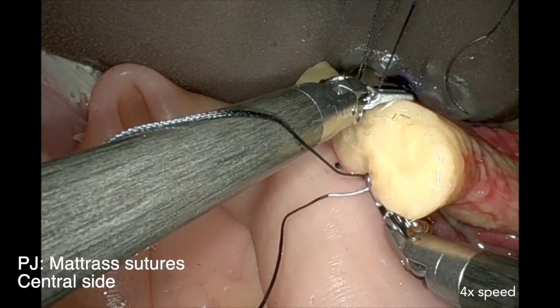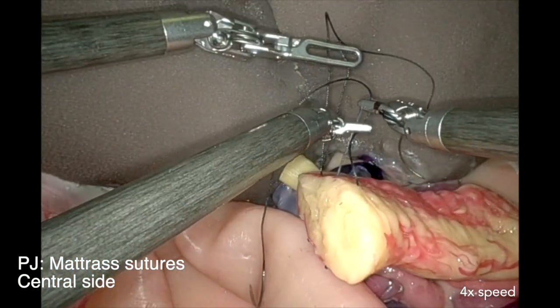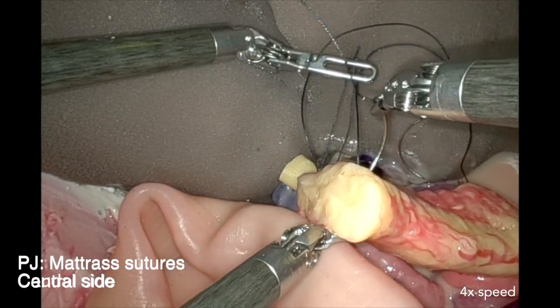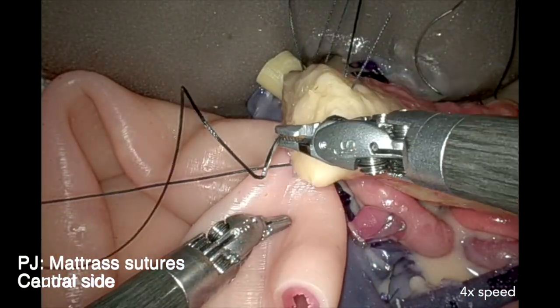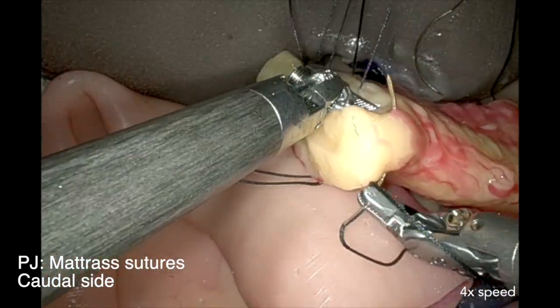The third arm also holds this suture to improve exposure to the anastomosis and the working field. The caudal mattress suture follows the same steps, and the positioning is such that almost a running suture line appears between the bowel and the pancreas.